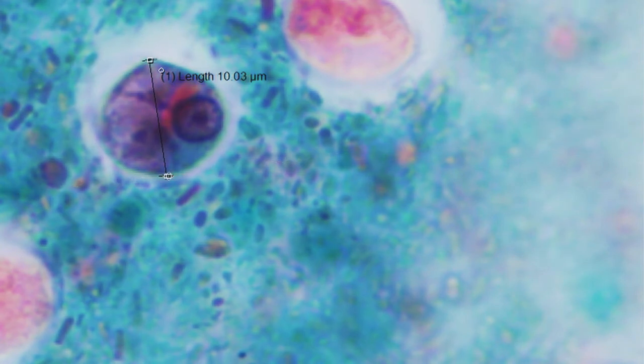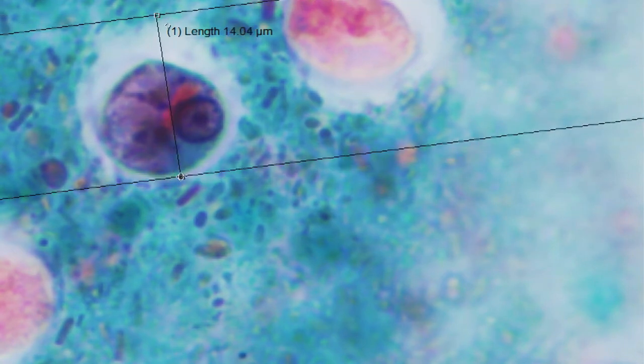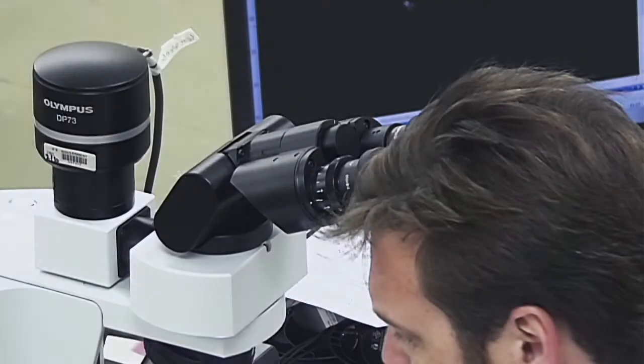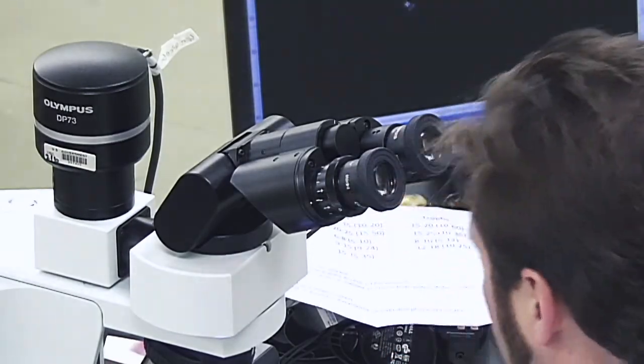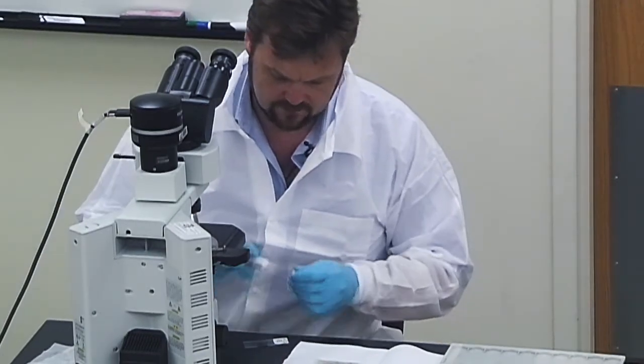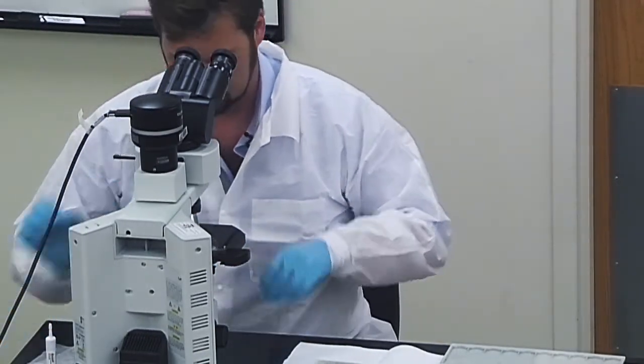I'm doing exactly what I've told everyone else not to do. I'm measuring the size there when it's actually, if we measure the size of the halo, we get about 14 micrometers, which is within that normal range for Entamoeba histolytica. So I'm happy that's a pre-cyst with 1 nucleus of Entamoeba histolytica. Let's move on to E. coli. Actually, I beg your pardon, we're going to have a look at trophozoites of Entamoeba histolytica before I move on to E. coli.